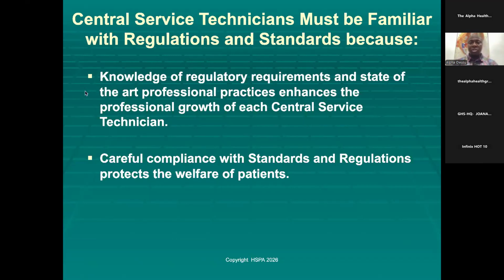And so the sterile processing technician who is working in this critical area doesn't know any standard and is working anyhow, they go and eat in their department. The standard says there should not be even water in the department. There shouldn't be food. There shouldn't be clothes, right? Our street clothes should not go there. These are mandatory standards, regulations.